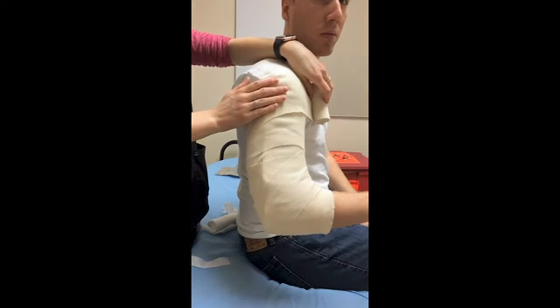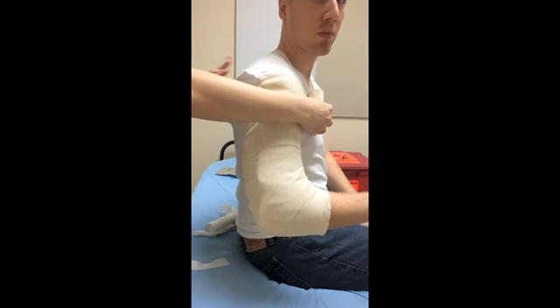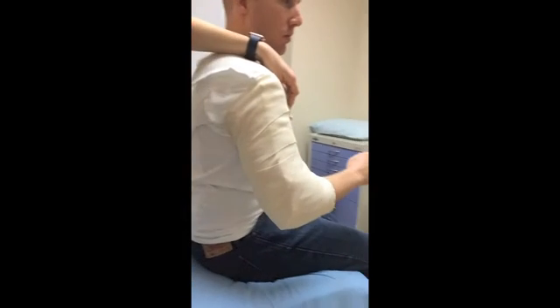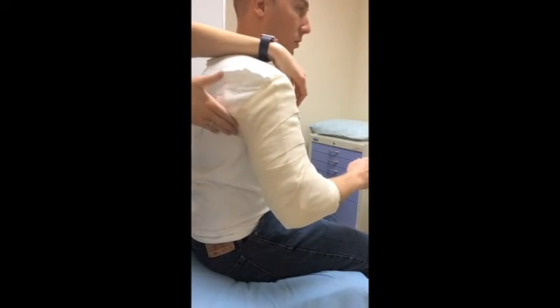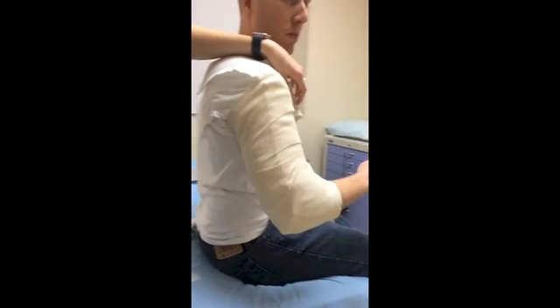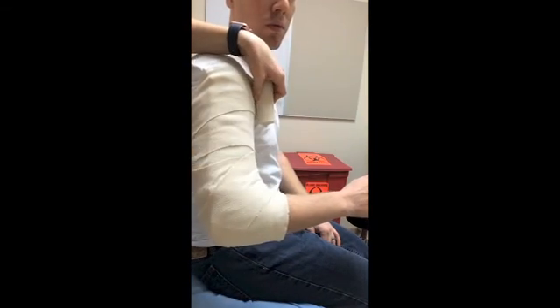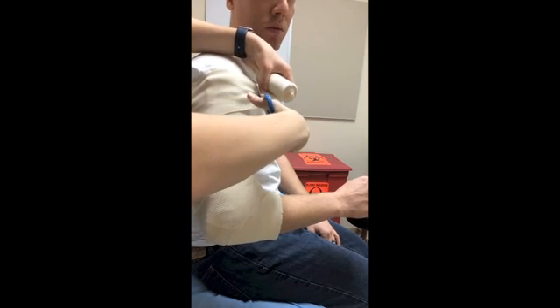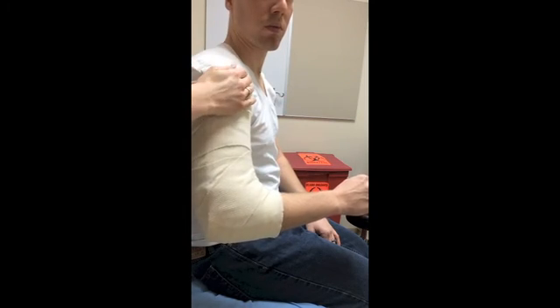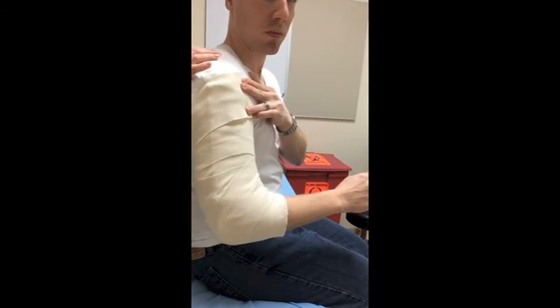Once in a while, a physician will ask that a little bit of bias or even an ace wrap be wrapped around the patient's midsection to capture this back piece of the splint. So we'll come around here, grab that end of the splint, and then around the rest of the patient's body. But for today, we're just going to end this bias and tape it here. And then education for the patient is very important on not moving too much, picking at this bias, or allowing it to loosen from the shoulder here.